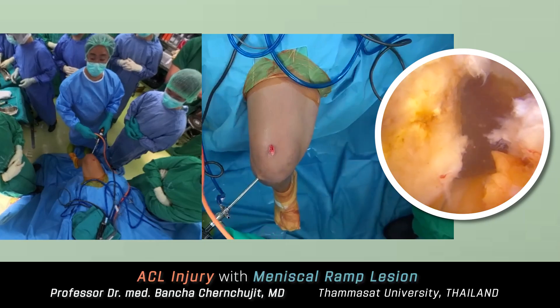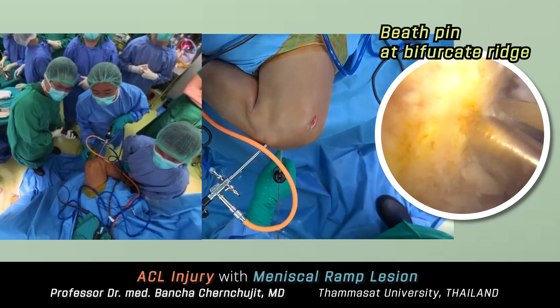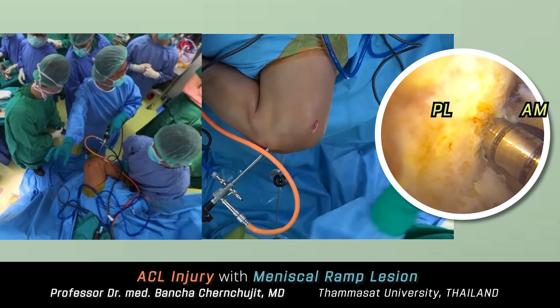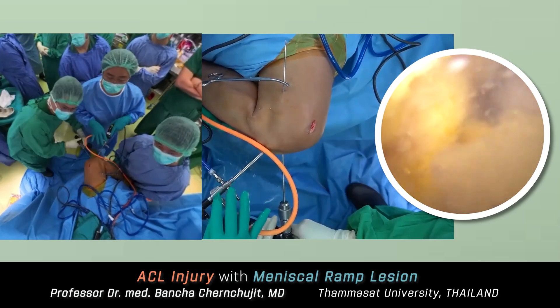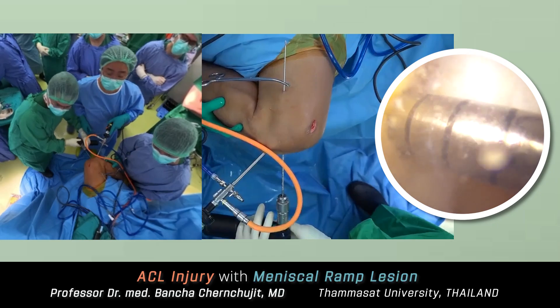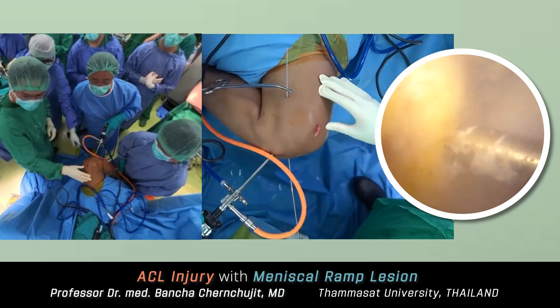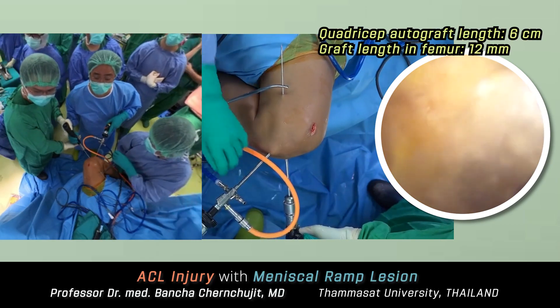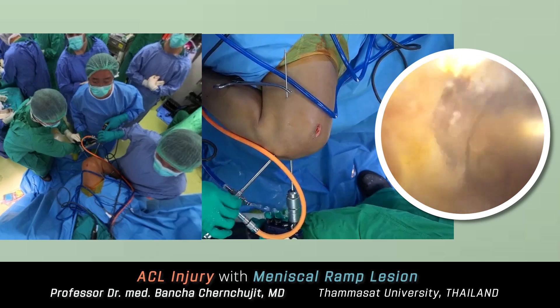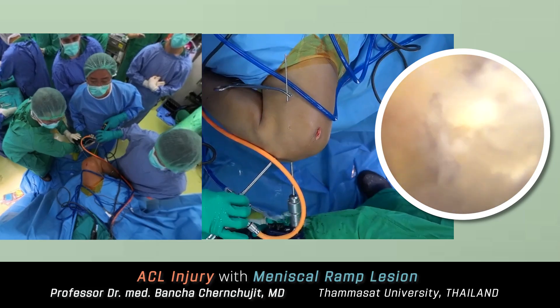Now we focus on the femoral side. With the 70-degree lens you get a wider view of the ACL femoral footprint. I will create the femoral tunnel — the guide pin is on the bifurcate ridge, between the PL and AM bundles. Make sure to read the scale before the cannulated drill penetrates the far cortex; if it's more than 20 millimeters, that's fine. I prefer the femoral tunnel length to be around 30 millimeters. After preparing the graft, it measures 6 centimeters in length; I prefer the femoral socket to be 12 millimeters. This technique is called step reaming — start with the smallest diameter, gradually increasing, so we won't blow out the posterior cortex.